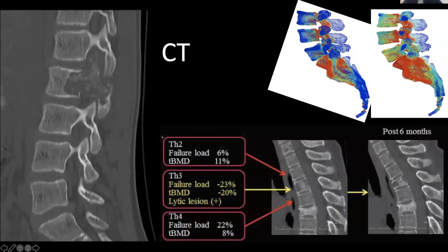CT depicts cortical bone very well. You also have some assessment of the trabecular architecture of the bone. For example, here you can see an infiltrative lesion. For orientation, you have your vertebral bodies, your pedicles, your posterior elements including your lamina and the pars articularis, depending on the orientation of the CT.